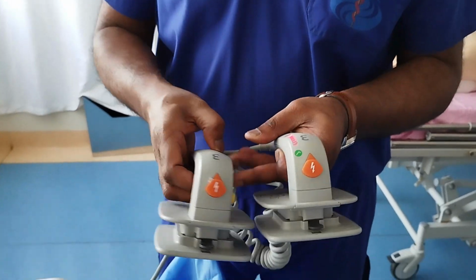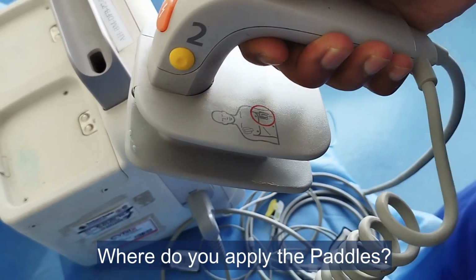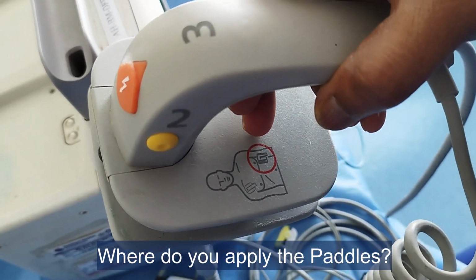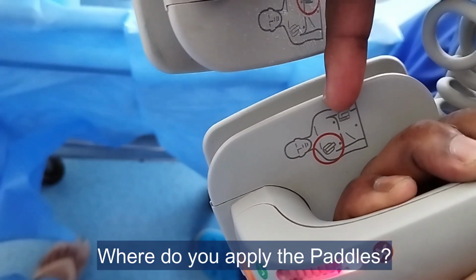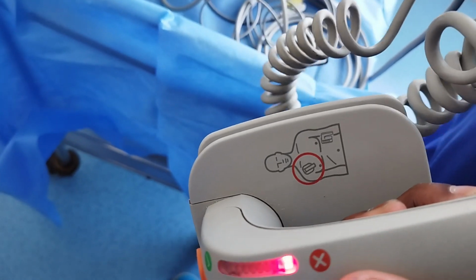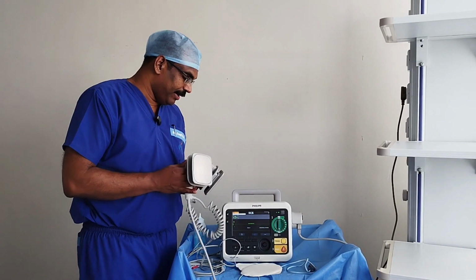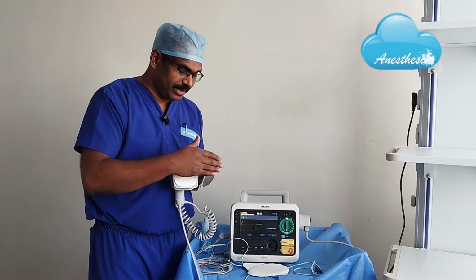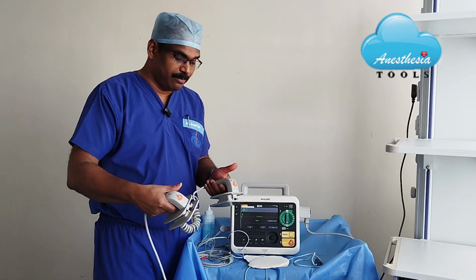Again, if you come to the paddles, you can see this paddle can be applied to the apex of the heart, and the second paddle can be applied onto the right infraclavicular part. So once you have taken the paddles in your hands, you can apply jelly so that electrical contact with the body will be nicely maintained, and then apply onto the body.